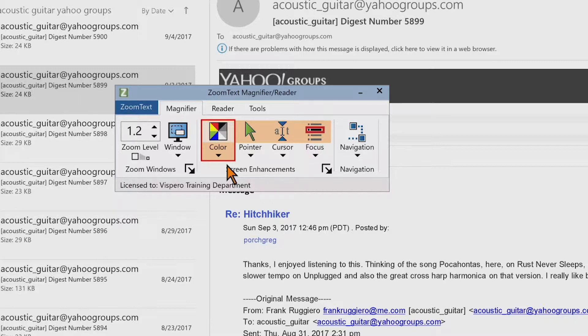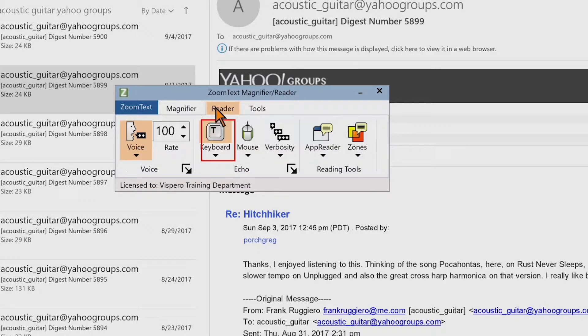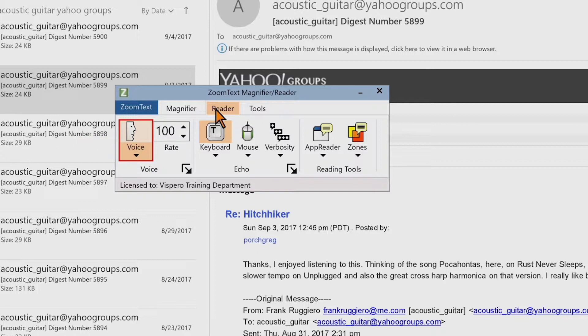Clicking the Reader tab displays toolbar controls for ZoomText screen reading features. The Voice group box Voice button access key is Alt-R, V. Pressing Enter on the voice button disables the voice, and pressing Enter again toggles it back on.